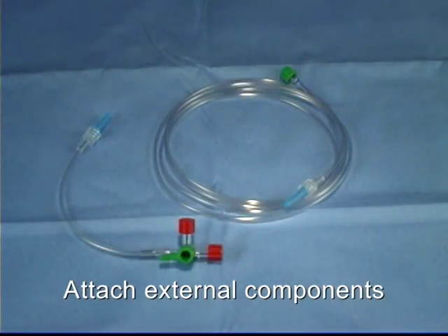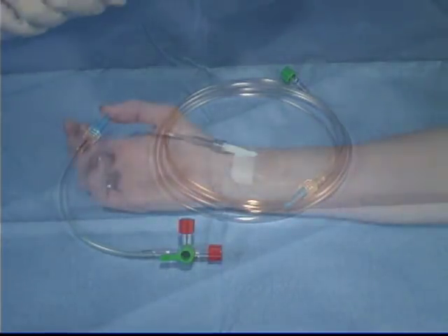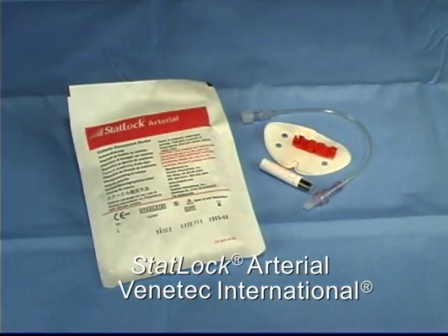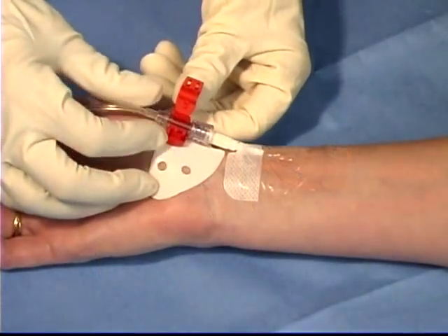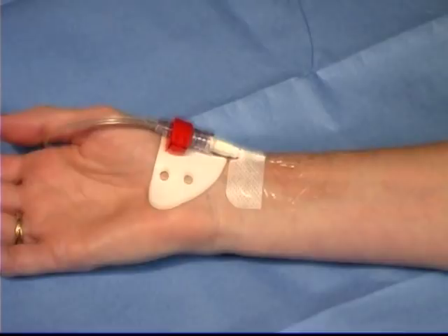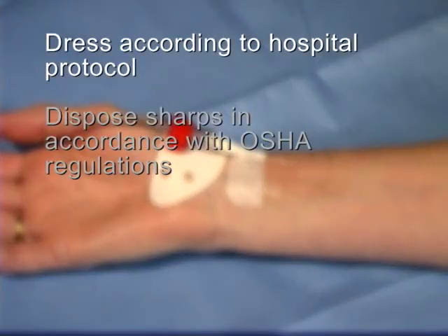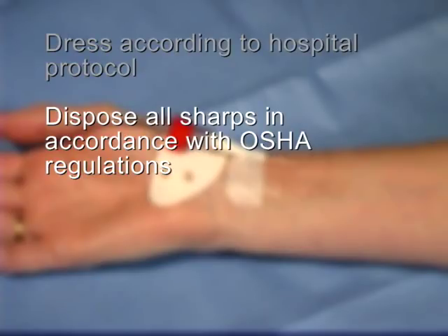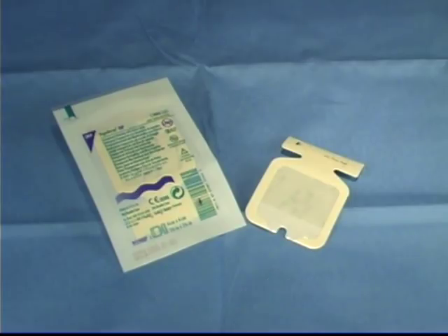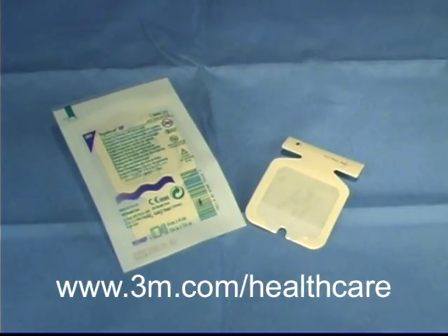Attach the components you will be using, such as the stopcock, injection cap, or pressure tubing. Secure the catheter to the patient. This program shows the use of a catheter securement device made by Venetec International. The use of this or other safety devices further reduces the risk of needle stick injury by eliminating the use of sutures. Dress the insertion site according to your hospital's protocol and finally dispose of all sharps in accordance with OSHA regulations. The dressing shown in this program is Tegaderm HP from 3M Corporation.